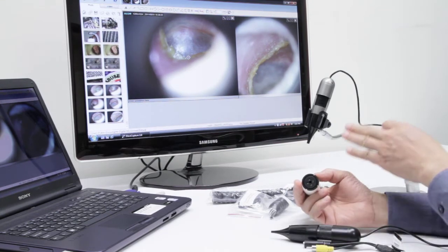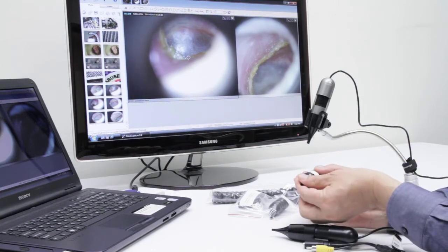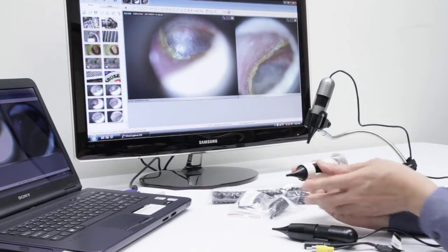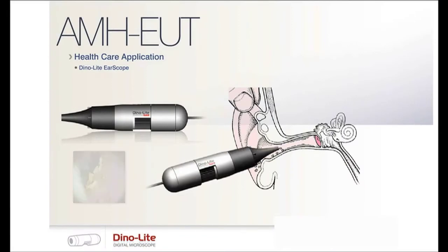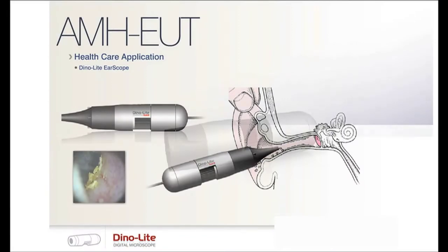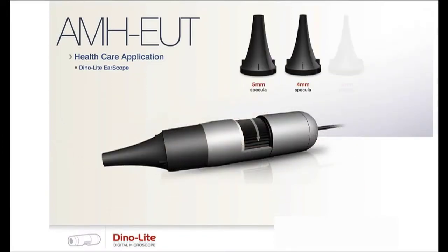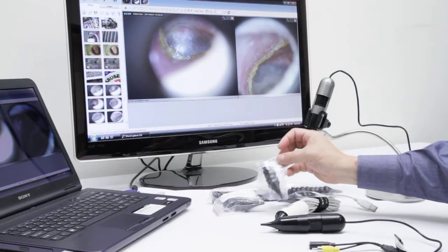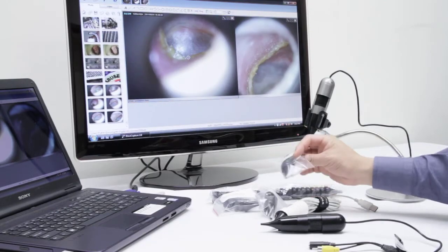When using the otoscope, simply attach the ear specula to the end of the scope, then gently lift the ear and place the scope into the ear canal. Our otoscope comes with three different sizes of specula: five millimeter, four millimeter, as well as three millimeter.